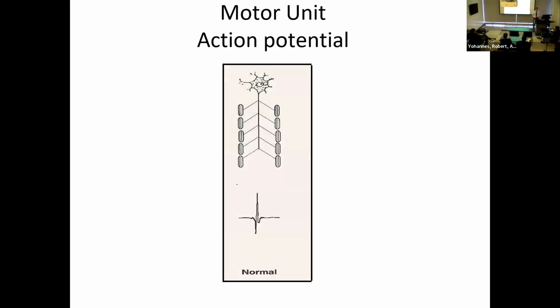Going back to our famous scheme, here we have a normal motor unit on the screen. Again, we said that this is an ideal unit where we put the needle right smack in the middle. And what we see is the electricity coming towards the needle underneath, which is maximum, and then goes away.